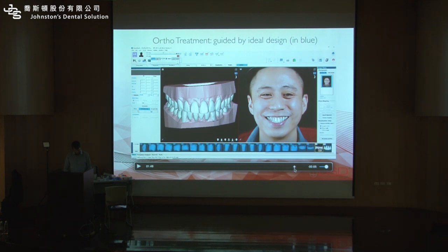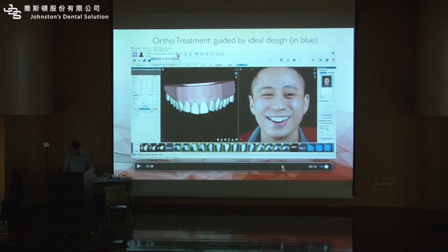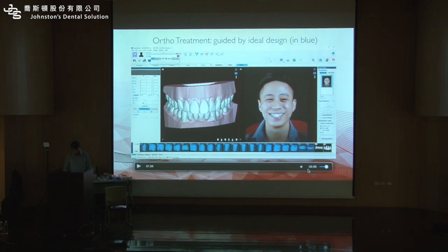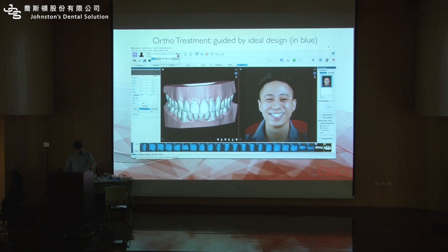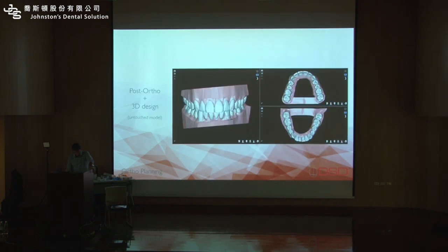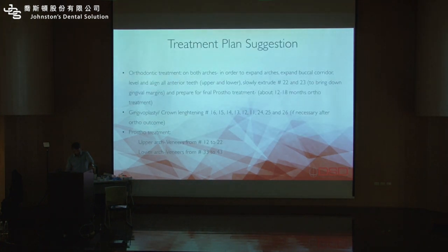Bring the lower. And these are the restorations. So this is before ortho or after ortho, before ortho, after ortho, and with the restorations. Some images to help show to the patient. After ortho, the restoration design, and then a report of suggestions of treatment.